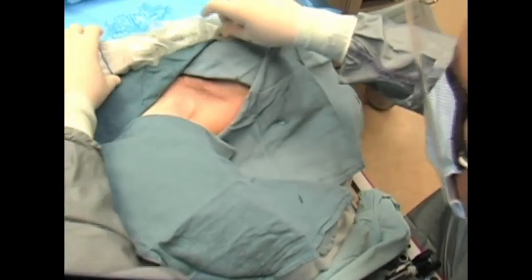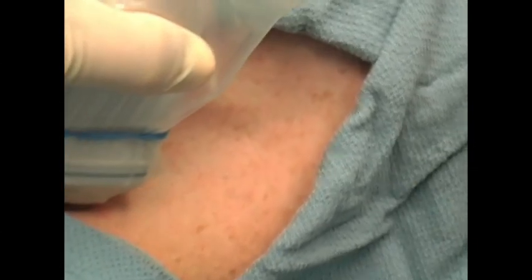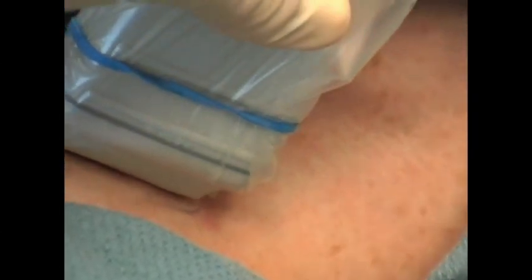We're going to proceed with the middle approach to the IJ. He's going to place the transducer on the patient's neck with the indicator towards the patient's left side. The transducer will be placed slightly above the clavicle, with the medial or indicator side slightly angled towards the patient's feet.